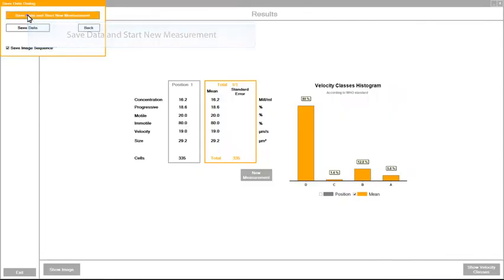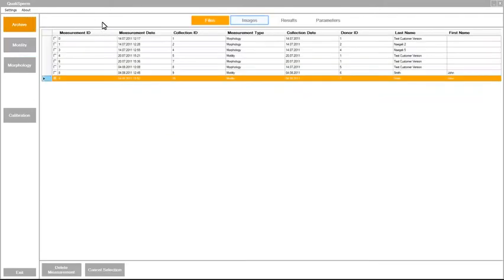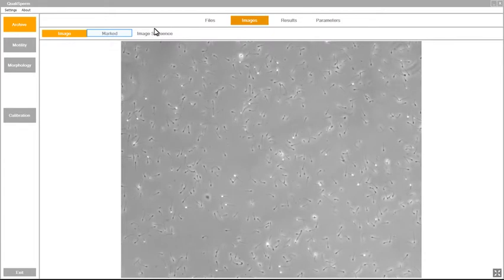Accept the results after which you can go to Archive to see the results which include the sperm trajectory and image sequence of the moving sperms.